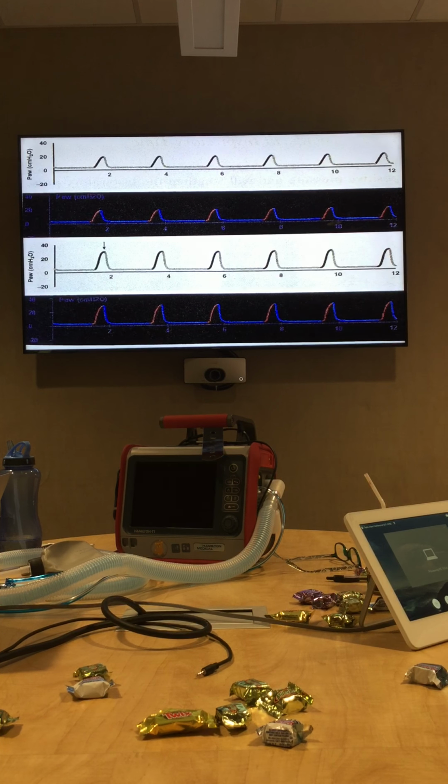So what do you think that actually does? What does it do to our oxygenation? Increases it. Exactly. Why? Because it gives the O2 longer to be in there for gas exchange. Exactly. It increases FRC within the lung, okay, by doing so. At the same time, what other disadvantage could it be? Increase intrathoracic pressures. Exactly. Okay.